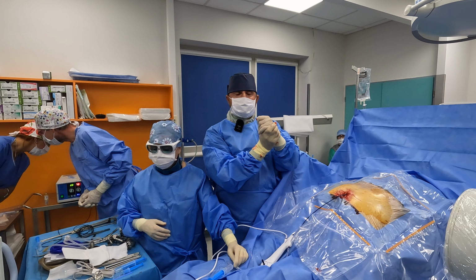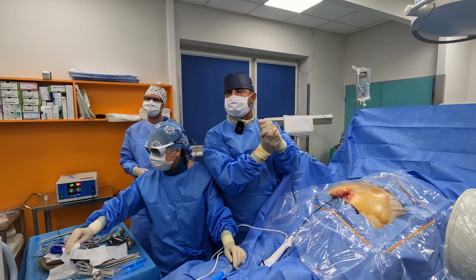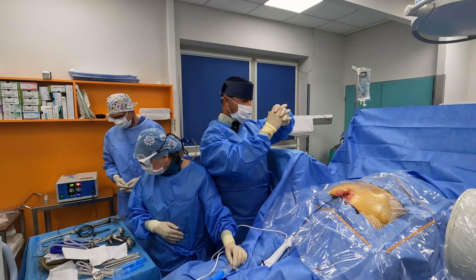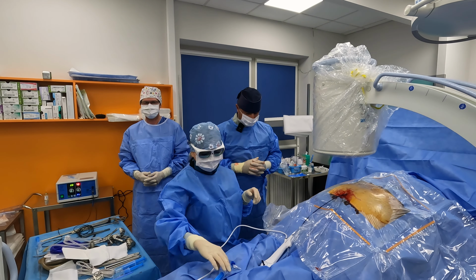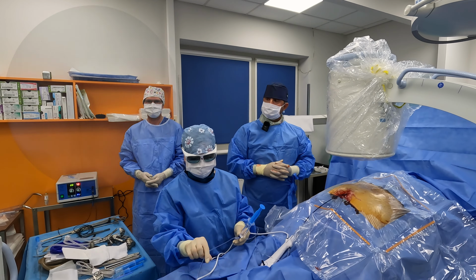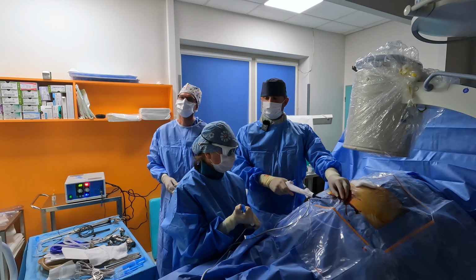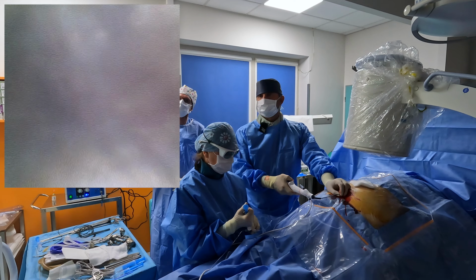And what we would like to do is do this in the anterior epidural space. But also, because his pain is on the right side, we would like to see if we're on the right side right now or on the left side. So we need AP projection to have a look at where we're aiming from the very beginning. So we're going to check the direction of the epiduroscope regarding the side, and what we would like to have is aiming to the right side. So now we can have a look at the epidural space itself.